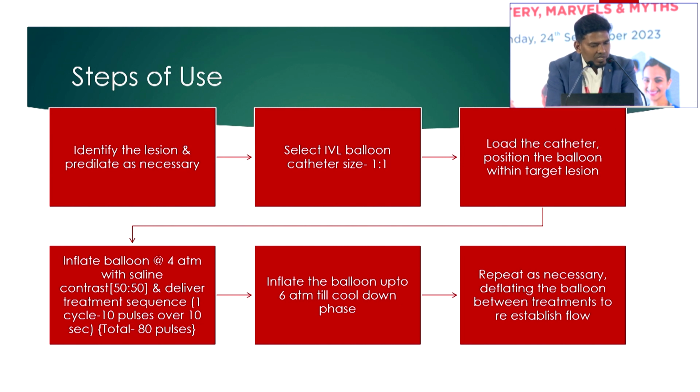So we will deliver a single cycle, which means 10 pulses. Depending on the lesion, you can go up to 80 pulses, and we can inflate up to 6 atmosphere pressure and till the cool down phase. And we can repeat as necessary, depending on the lesion.